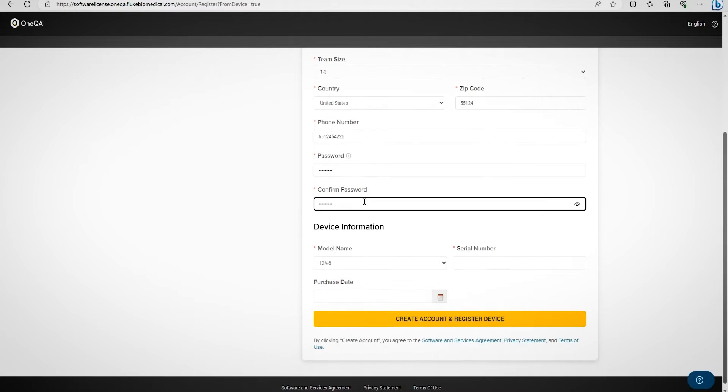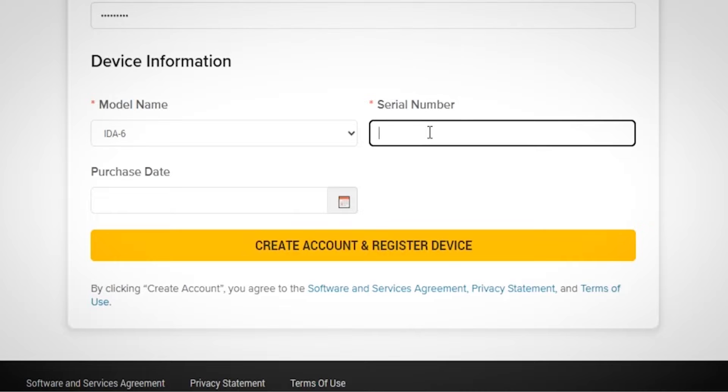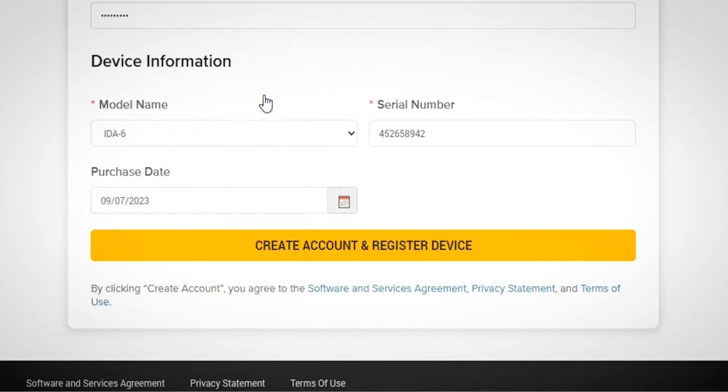You can locate your serial number on your IDA6 device. Find the serial number and enter it into the system, along with your purchase date.